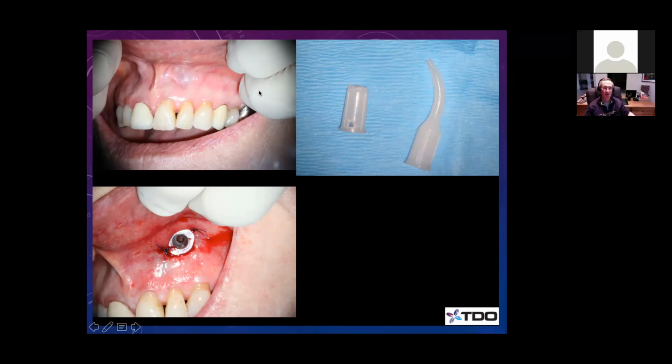So you make an incision in the soft tissue and then put some sort of tube in there. Like you see here, this is just a composite tip with the end cut off, and put a couple holes in there so you can suture it in place. And then the patient flushes this out a few times a day with chlorhexidine every day. Usually about 4 to 6 weeks is enough to get the bone loss to start healing, and then you can take this out. In some cases that won't heal just by conventional root canal treatment, this will get the process started. And sometimes they'll heal completely. Sometimes they'll just shrink down to a certain size, but then you can safely do apical surgery if you need to.